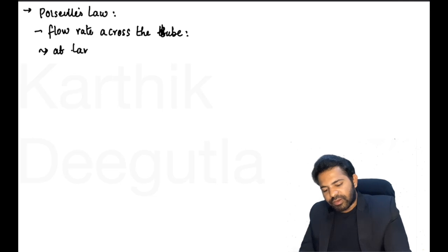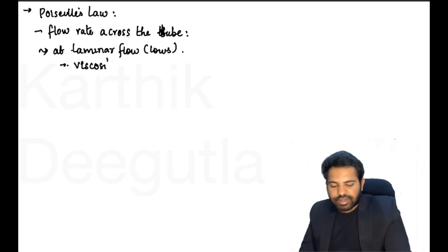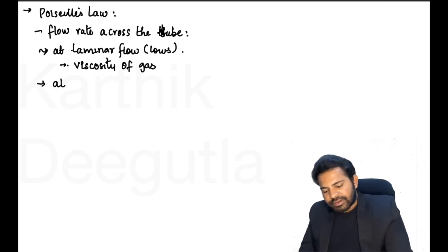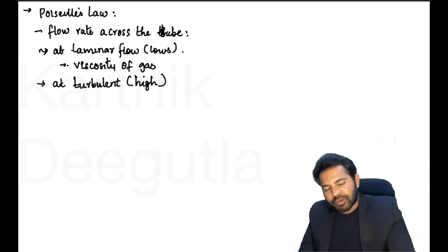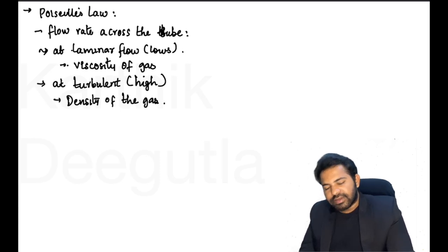At laminar flow or at low flows, the flow rate depends upon the viscosity of the gas. And at turbulent flow or high flows, the flow rate depends upon the density of the gas. Is this clear?